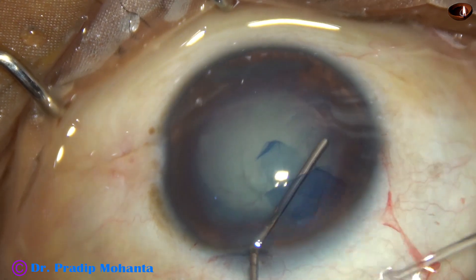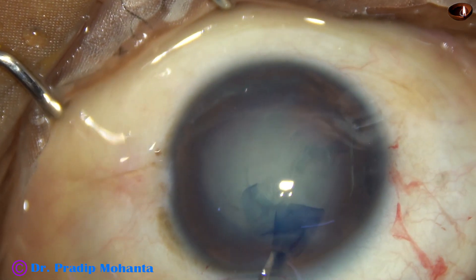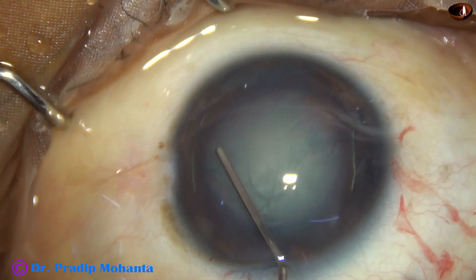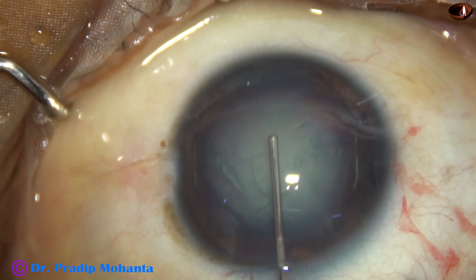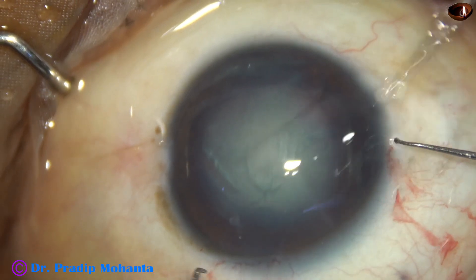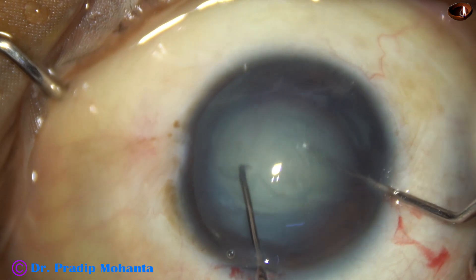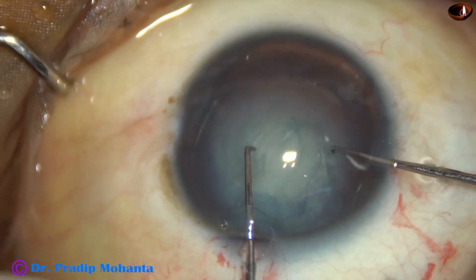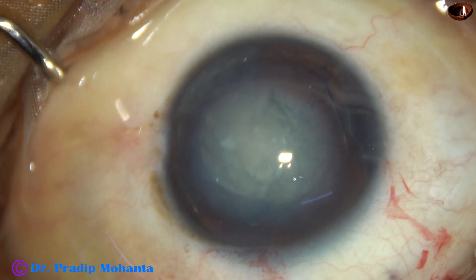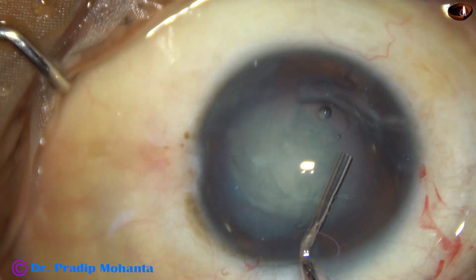Now, hydrodissection was done nicely. The nucleus is tapped. Hydrodissection is done at another place. The nucleus is tapped again. And now, I don't try to rotate the nucleus single-handedly. After injecting some visco, the nucleus is rotated bimanually. Whenever there is a zonular tear, remember to rotate the nucleus bimanually — it causes much less zonular stress.